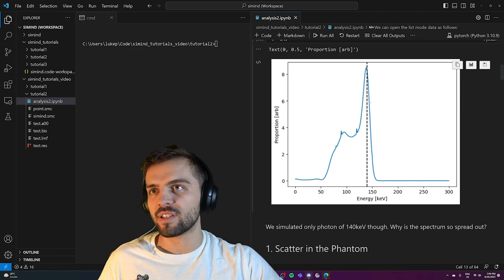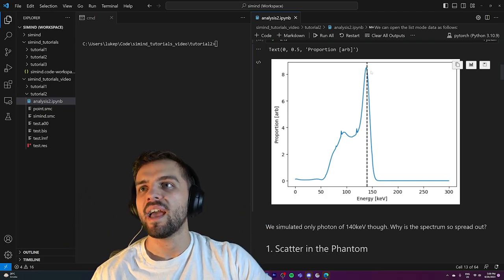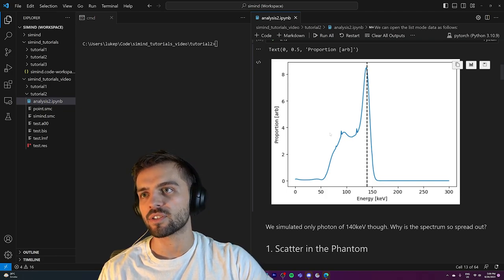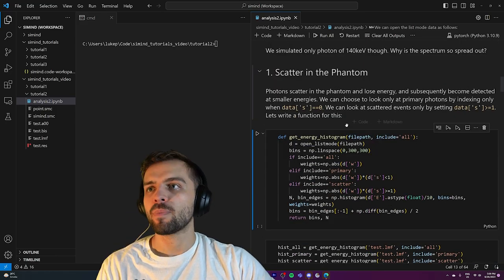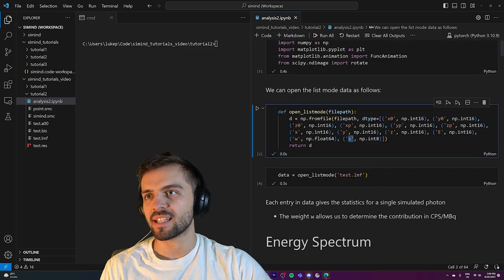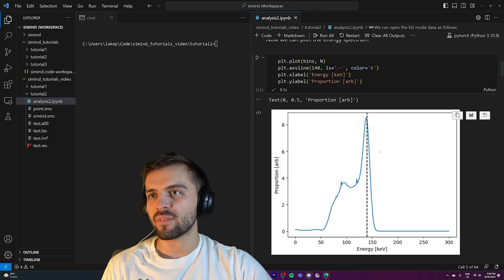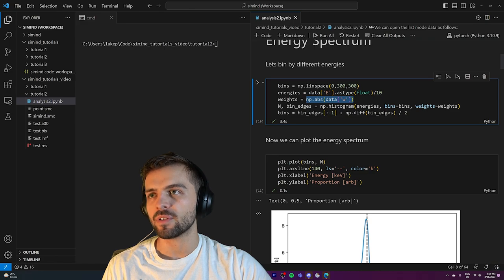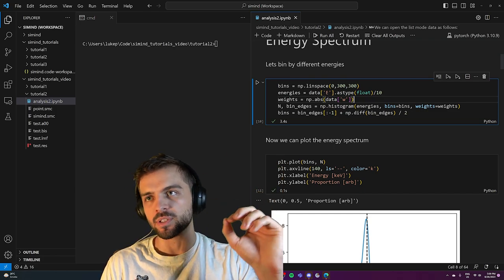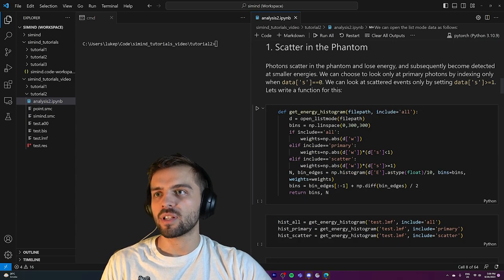A lot of these photons correspond to ones that have scattered and have less energy. We can look at scattered photons by examining the scatter order S — which contains the number of scatters. I weight events by counts per second per megabecquerel, multiplying weights by zero or one: zero if scattered multiple times, one if it hasn't scattered, to look only at primary photons. That's what I do here.